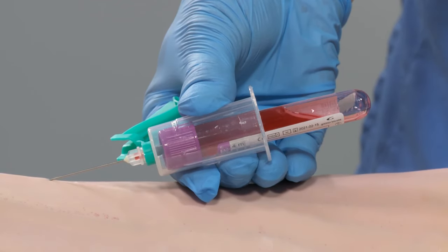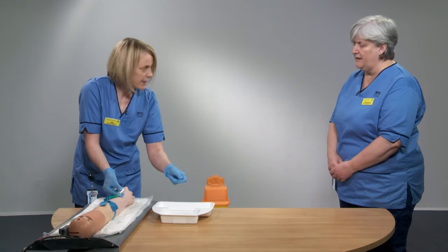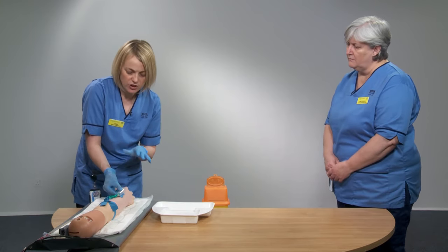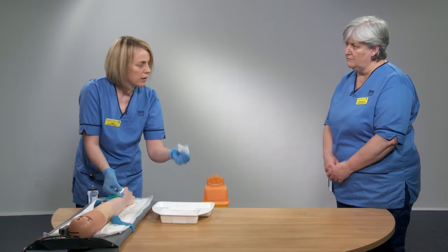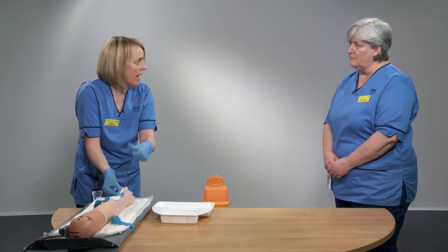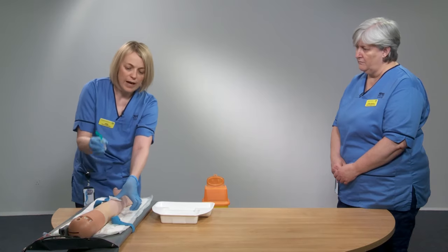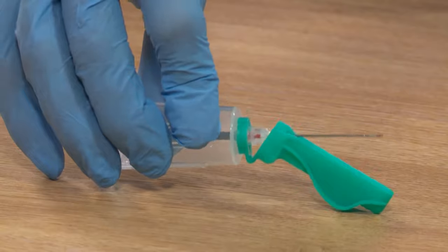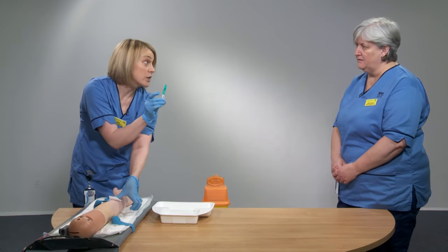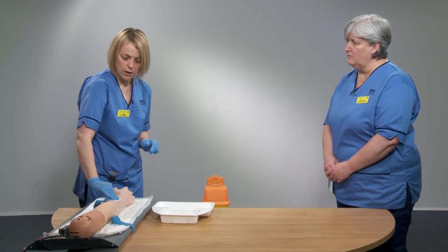Once flashback is seen, keep the needle hand absolutely still and use the other hand to attach the blood bottles, pushing them in with your thumb. Allow each bottle to fill and stop, then remove and invert a couple of times to mix the contents. Attach multiple bottles in the correct order if required. When all samples are taken, remove the tourniquet, place the gauze swab gently over the needle — being careful not to press down while the needle is still in the vessel as this can cause bruising — then withdraw, press down, and on a hard surface activate the safety shield until you hear the click. Go straight skin to bin.